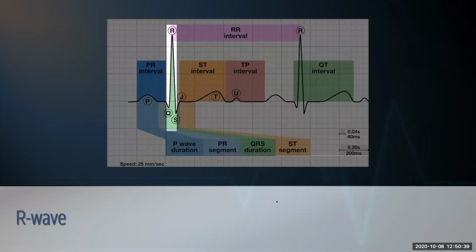So that was a very quick review of bundle branches, whether it's a left bundle, right bundle, left anterior versus left posterior, going into even delta and Osborne waves as well. What questions do you have before I go on to R wave?